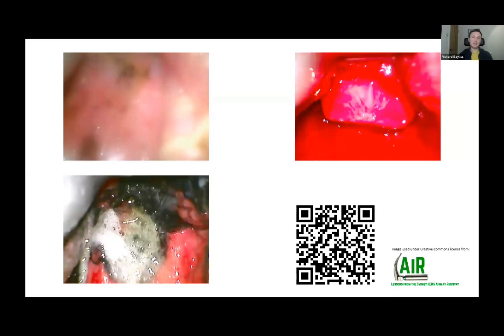Most of the devices have internal ways of getting rid of fog off the camera lens, but even if you only lose your image for a couple of seconds, that will still impact what you're doing. There are also issues related to getting blood or vomit on the camera, and that can obscure the view to a point that you can't proceed with videolaryngoscopy.